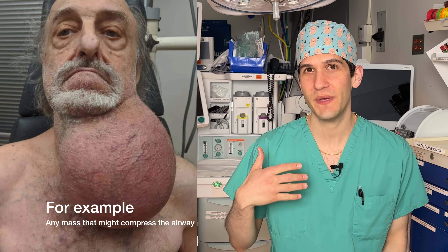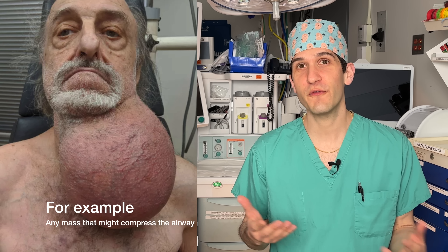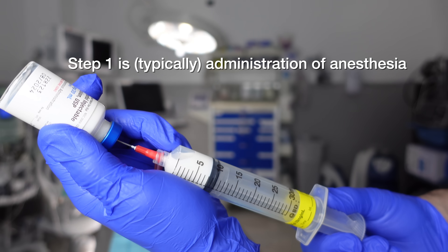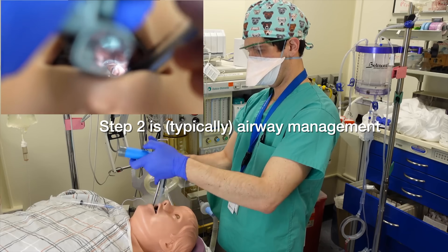The reason why an awake intubation would be undertaken to begin with is any circumstance where it would be extremely dangerous to have a patient anesthetized and potentially lose their ability to breathe on their own before we had an endotracheal tube in place. Ordinarily, if a patient is going to receive general anesthesia and have a breathing tube placed, anesthesia is first administered so that the patient is unconscious and does not have to go through the experience of having a breathing tube placed.